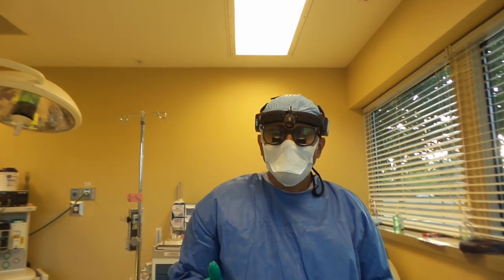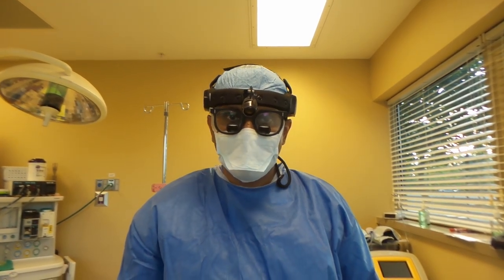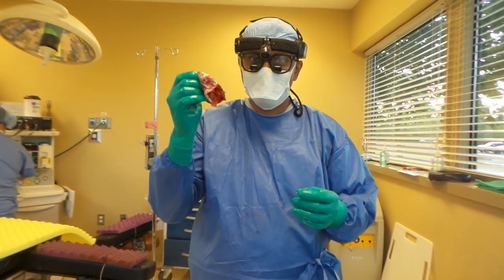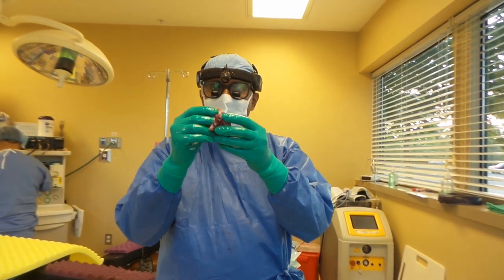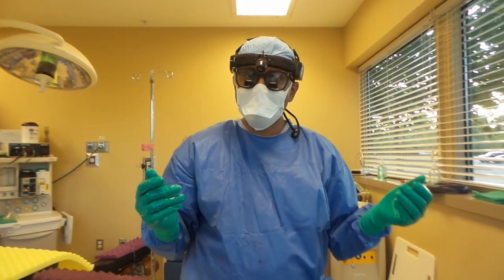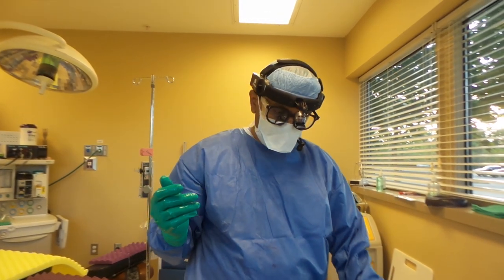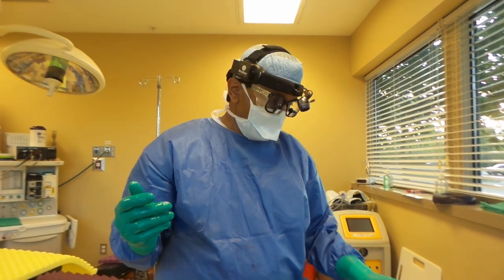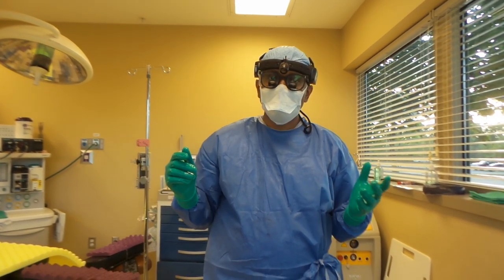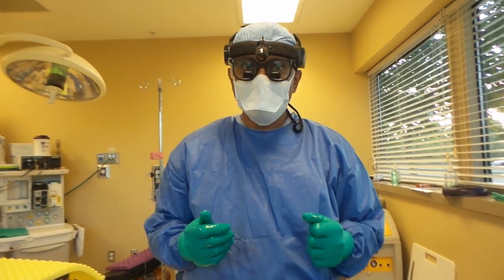Thank you very much. Hopefully you found this video helpful. Please share with your friends and anyone who will find this informative — and as to why you want to remove the capsule and the implant en-bloc, this is the reason why. I'm going to go ahead and send this to pathology so they can look and see exactly what this is. They will analyze for any malignancy slash silica, and do polarizable light to confirm this is indeed silica. I've already taken cultures from microbiology — aerobic, anaerobic, and fungal — and there was no abnormal fluids to send to cytology. Thank you again very much, all the very best. Dr. Khan from executiveplasticsurgeon.com.